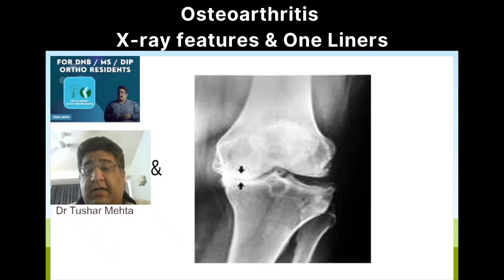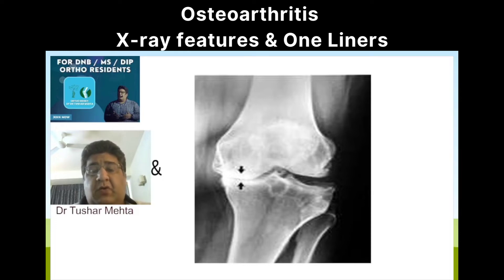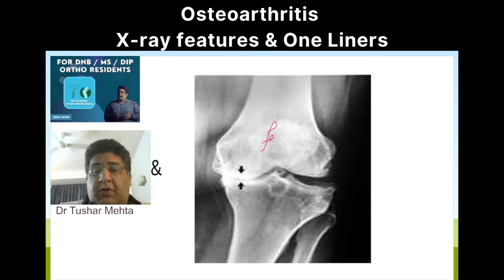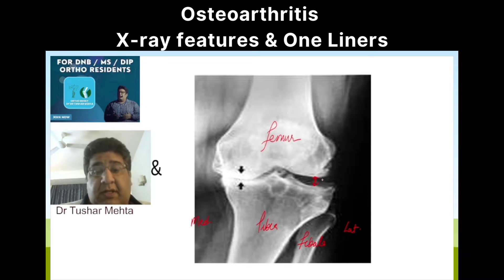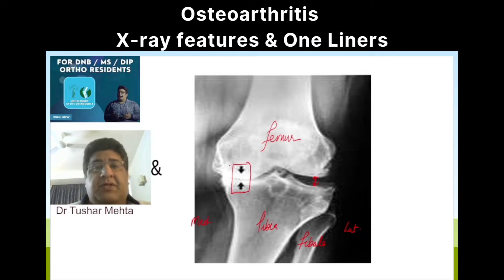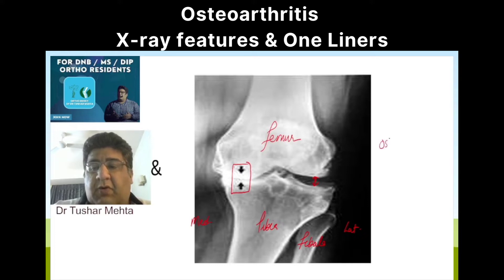Hello everyone, this is Dr. Tushar. Today's topic is in front of you. Just by looking at this X-ray, what is the one radiological diagnosis that comes to your mind? I'm sure you all can see the femur, tibia, and fibula. This is lateral, this is medial. We can see the lateral joint space, but we cannot see the medial joint space — there is a reduction of the medial joint space.